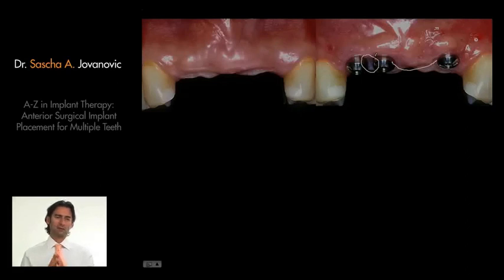And from evidence in the literature, we can say that the gingival papilla between 2 implants can create about 3 millimeters of height. And when we look at the gingival papilla between an implant and a pontic, it's about 5 millimeters. So that's quite a difference. So the pontic has an advantage.